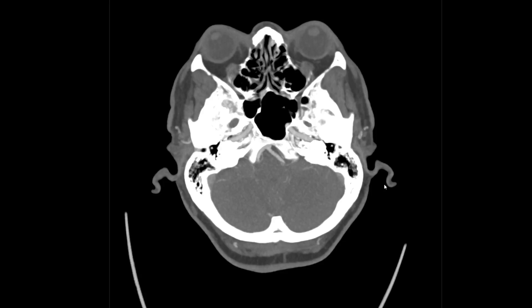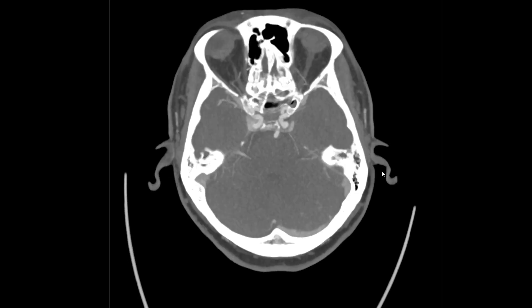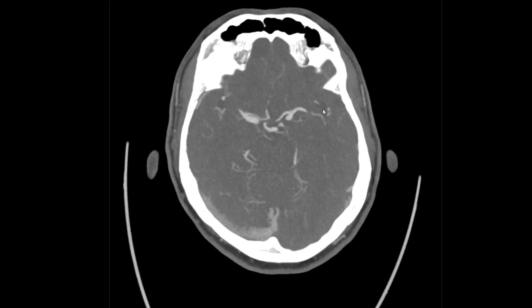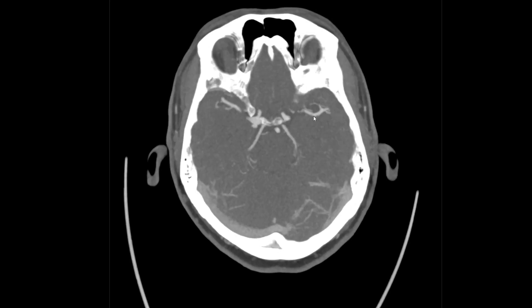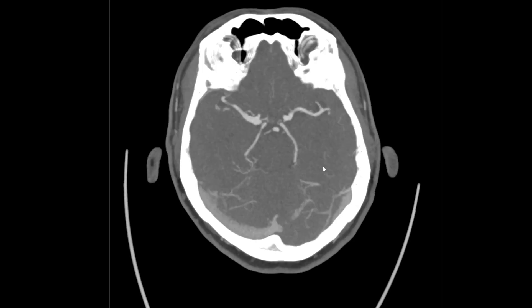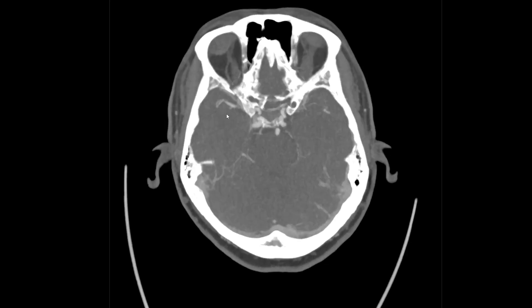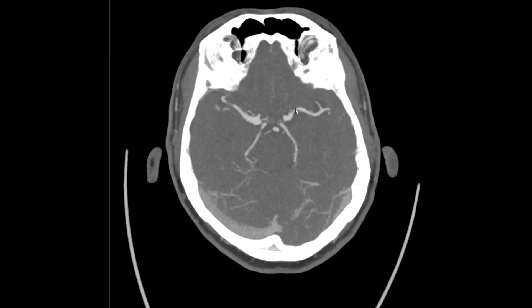MIPs, or maximum intensity projections, are a special type of 3D reformat where a thick slice is generated but only the brightest pixel value is counted. On the axial MIPs of this same case you'll recognize them by the flowing visualization of the vessels, allowing you to see their continuity. This is extremely helpful here because you can see the connectivity of that bilobed aneurysm much better. Axial MIPs also do a very nice job of laying out the MCAs in the sylvian fissures on both sides — an excellent way to see the entirety of the MCA quickly.